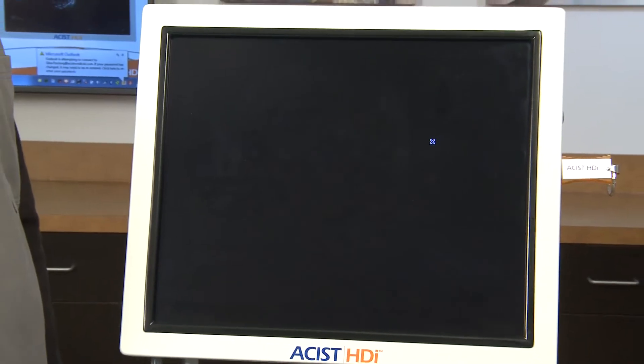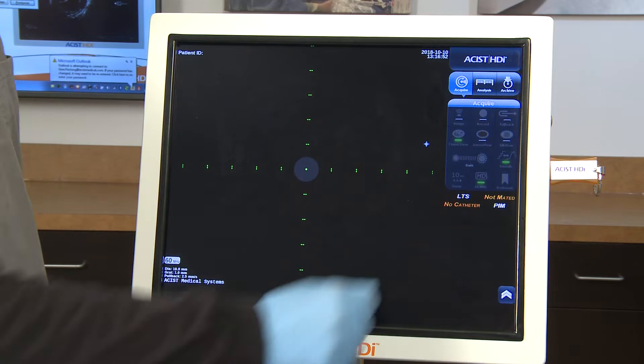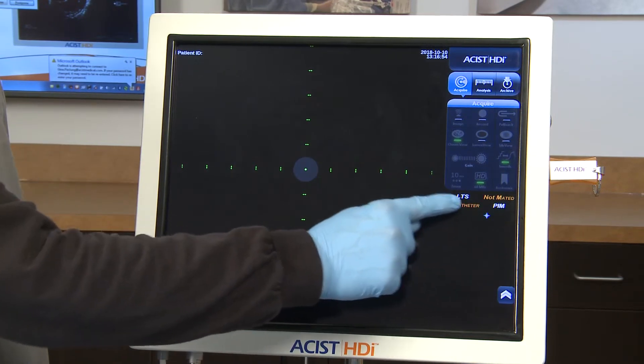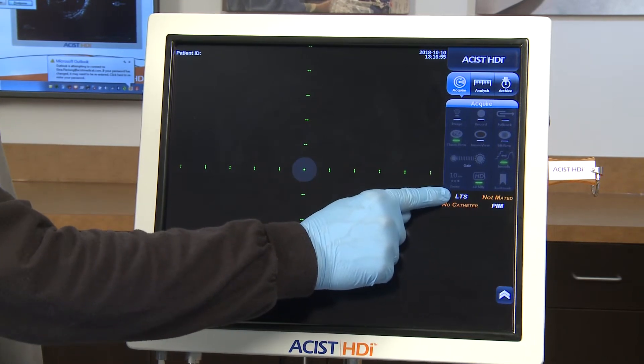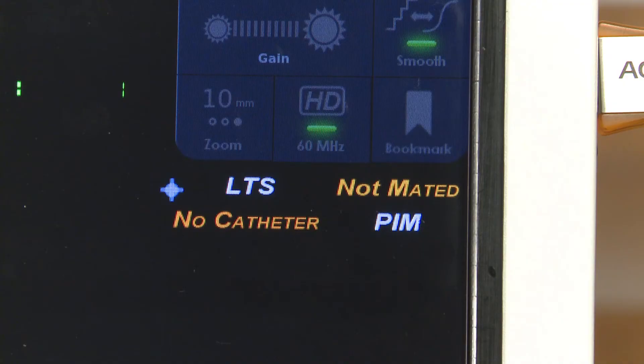After entering the correct system login password, the acquire screen will appear on the touch screen. If the optional LTS is connected, verify the LTS indicator is shown in white on the touch screen.